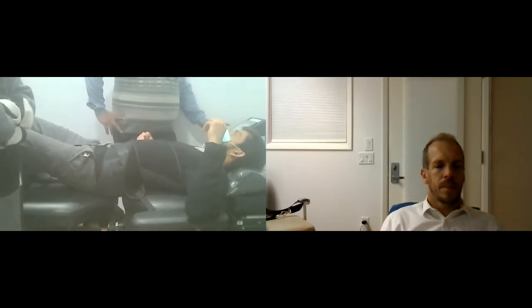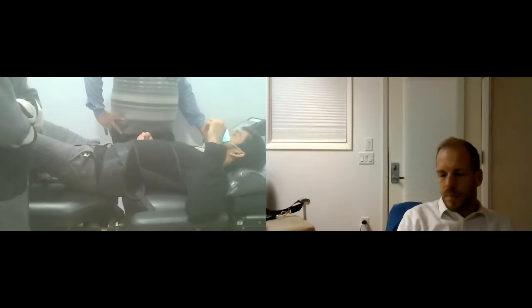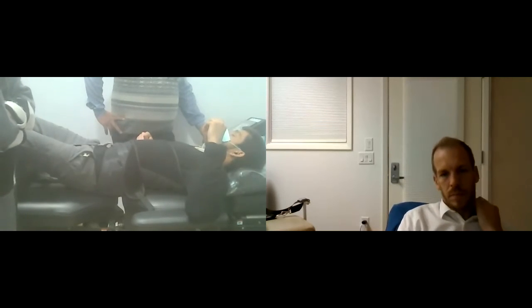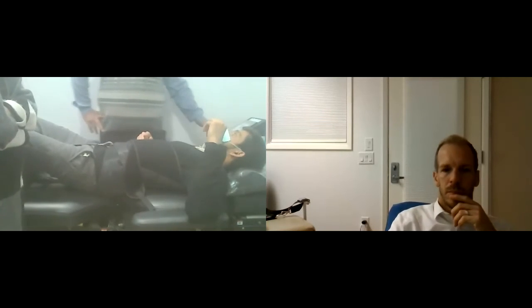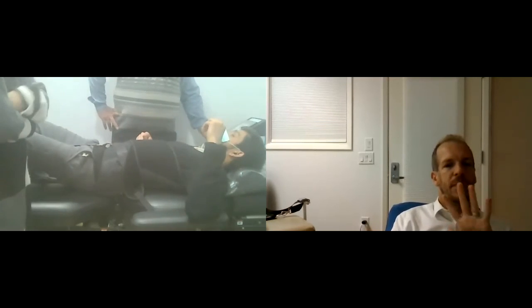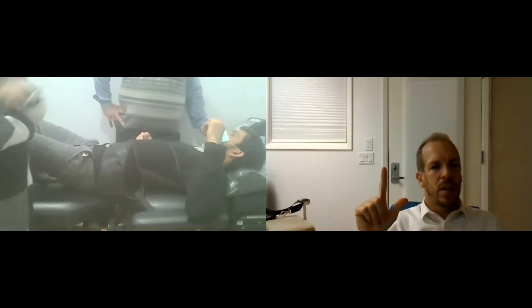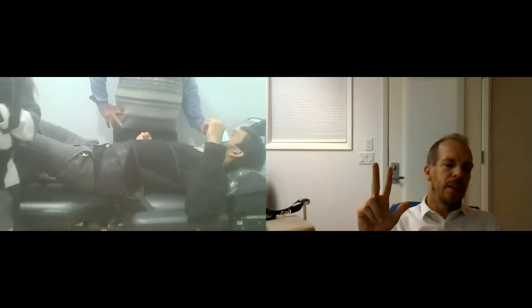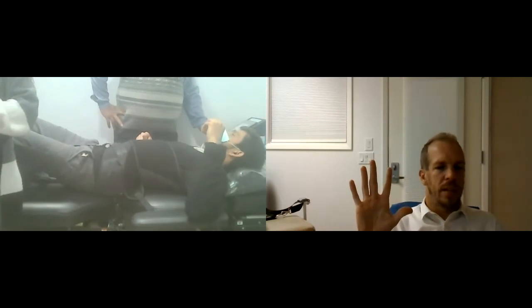Right now it's 4. The second minute, it'll probably go up to about 8 or so. It's a 5-minute warm up. Minute 1 is 4. Minute 2 is going to be about 8 or so. Minute 3 is going to be about 12 or 13. Minute 4 is going to be about 18. And then minute 5 is when we get up to our 22 kilograms that we put in.